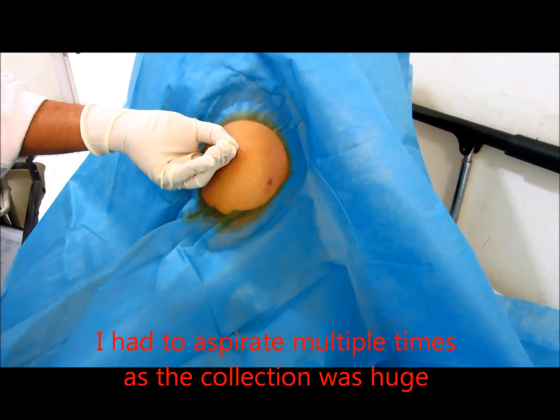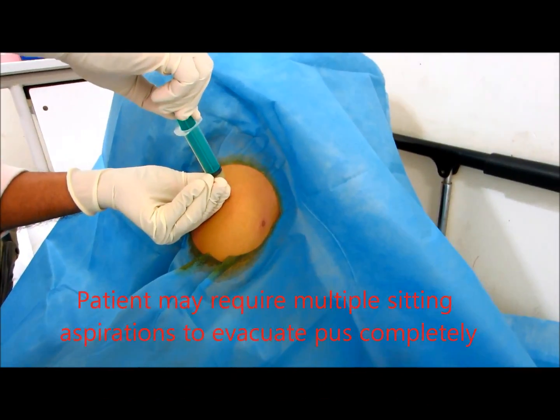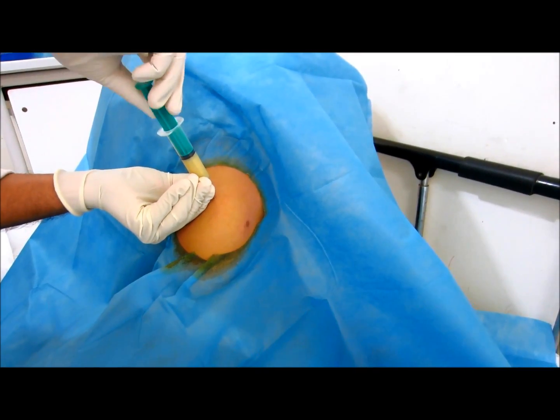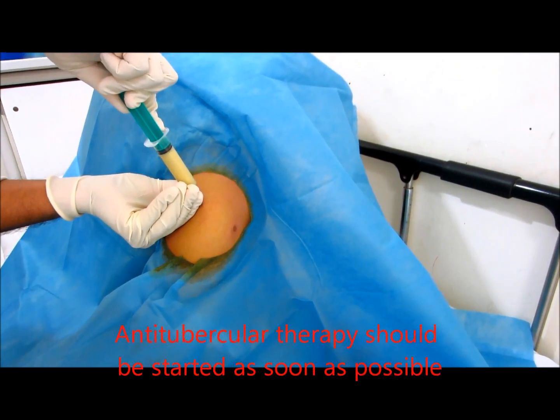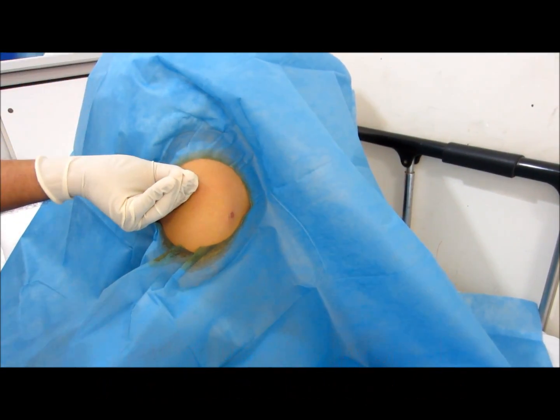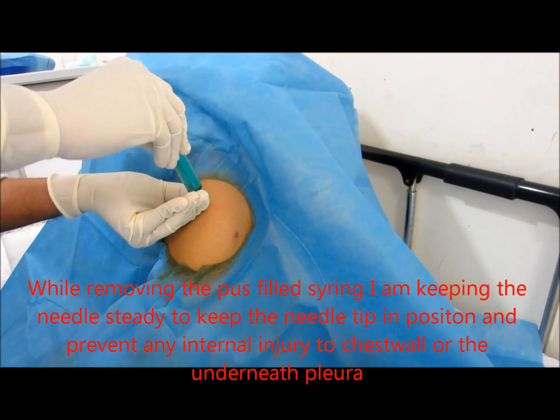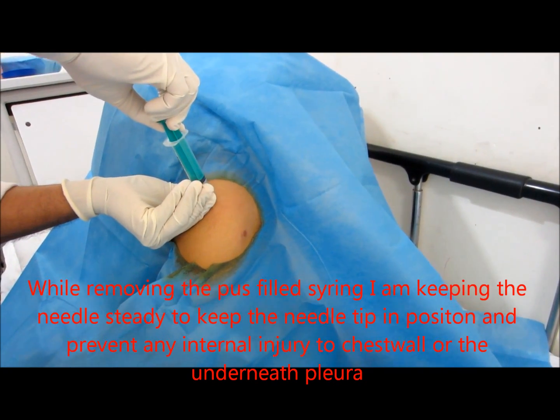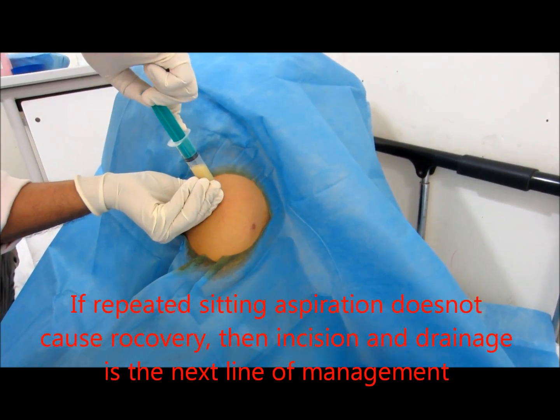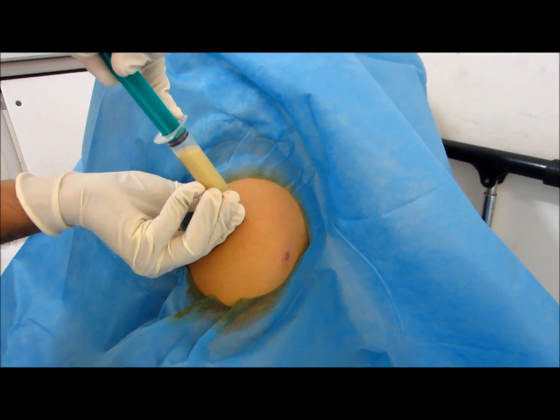May need to aspirate multiple times as loculation was present — the patient may require multiple sessions of aspiration for complete evacuation of pus. Anti-tubercular therapy should be started as soon as possible. While removing the pus, keep the needle tip steady to prevent internal injury to any adjacent structure or the pleura. If repeated aspiration doesn't cause recovery, incision and drainage is the next management protocol.